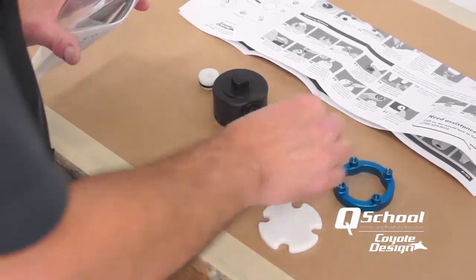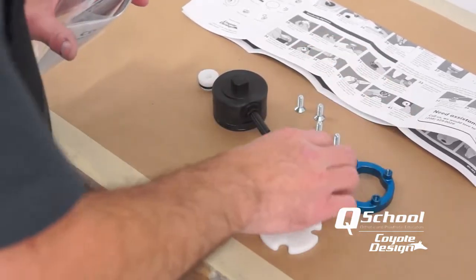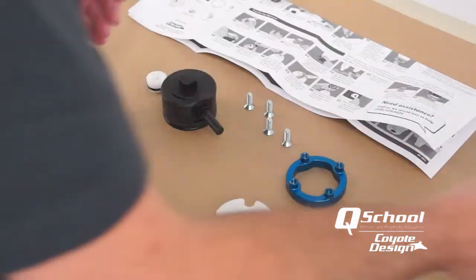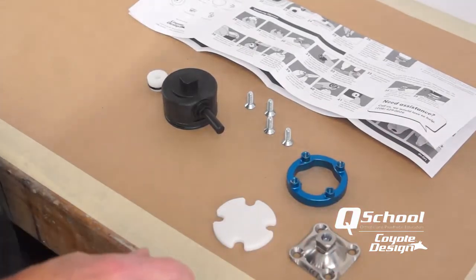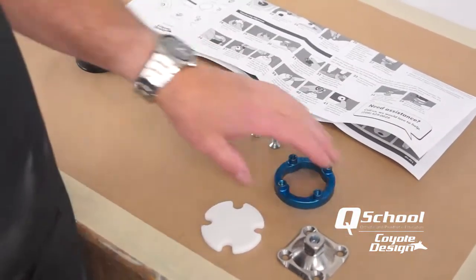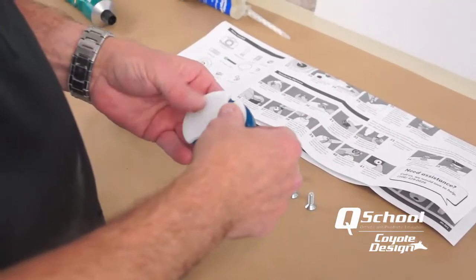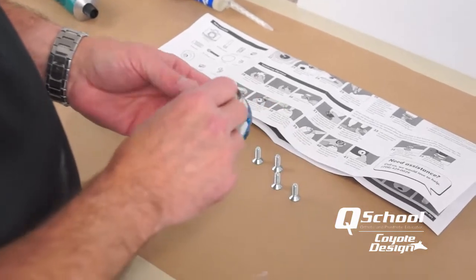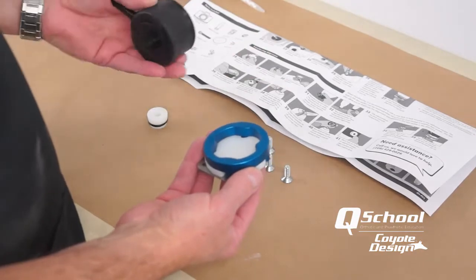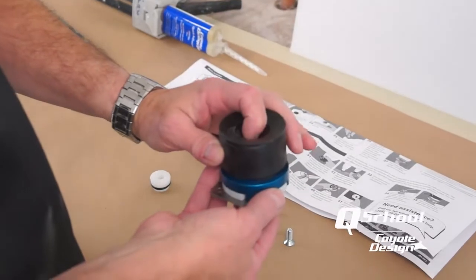In our laminating process we are going to transfer our alignment. What we will need to do first — just like we follow through in our instructions — is take our align-4, put our glue plate on it, put a pyramid on, and set that up in our transfer jig. We will fill this with Coyote Quick, have our lock on the end of our cast, set it down, and transfer.